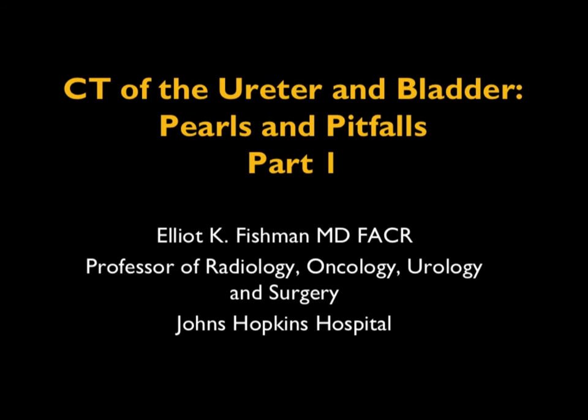This will be on CT of the ureters and bladder, pearls and pitfalls. I have given different talks to you discussing the bladder, discussing the ureter, but never really done it in any great formal fashion. So I thought I would do it, and that's what this talk is going to be about. This will be a several-part series.